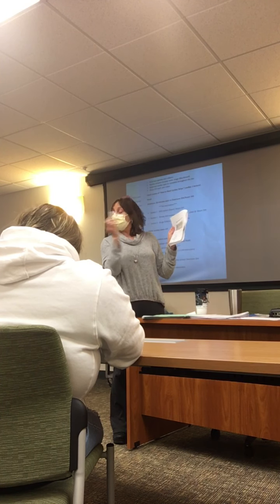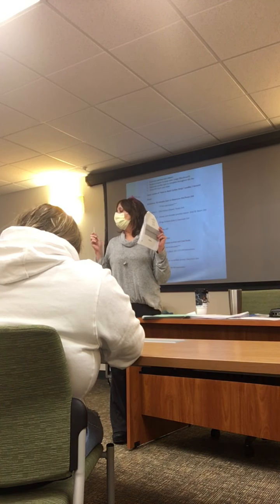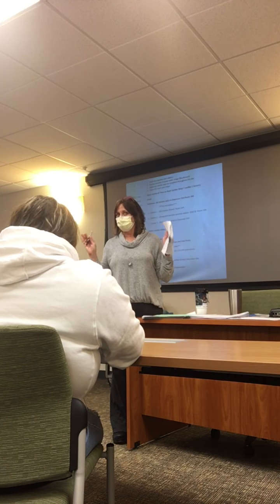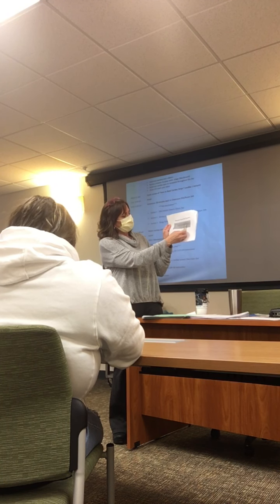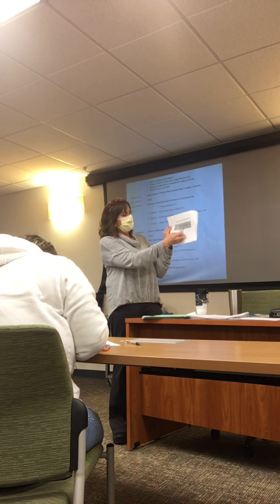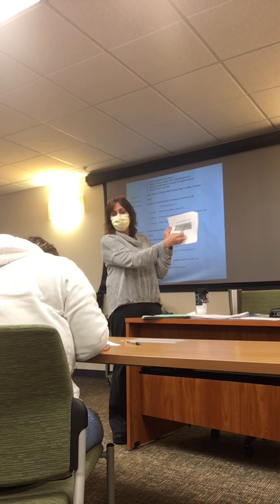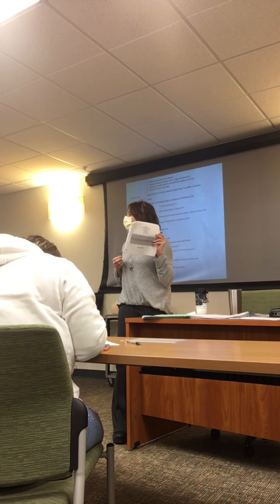Yeah, in some of them. When you see ectopic beats, we always have an underlying rhythm. So in the underlying rhythm, I can measure it. So let's measure the PR interval. What do you get here in these beats that look pretty regular? How many little boxes are you getting? 4. So what's my PR interval?